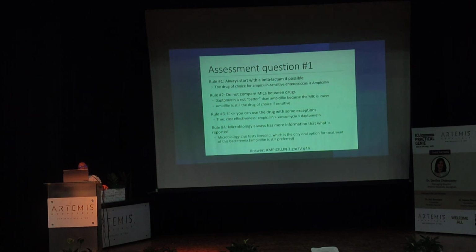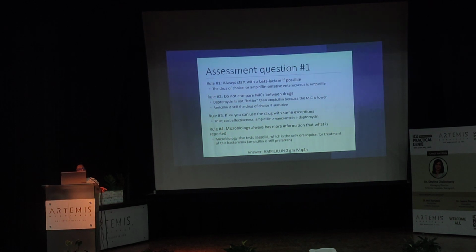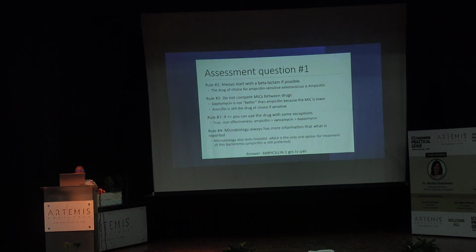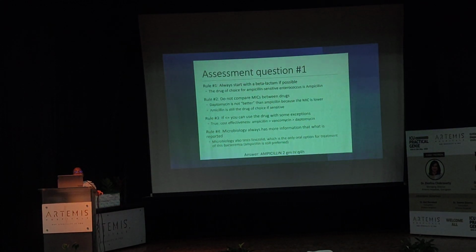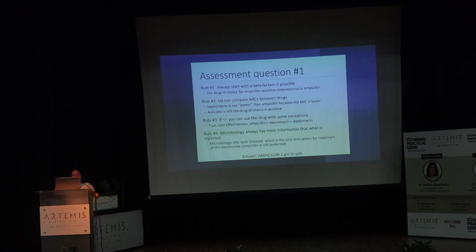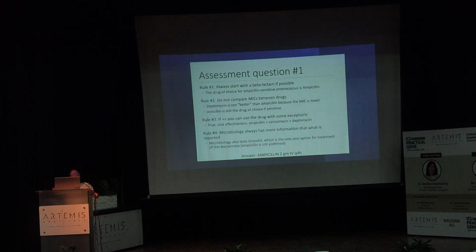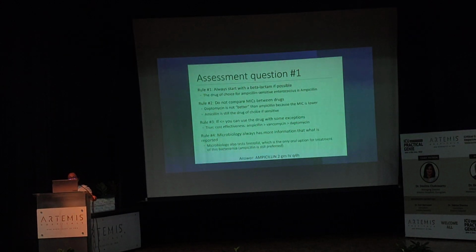Here also, the microbiologist always knows better. If we want to add an oral formulation for this vancomycin sensitive Enterococcus, then we have to ask the microbiologist whether he has tested linezolid sensitivity. If yes, then we can. That is the only oral formulation which can be added for Enterococci, right?